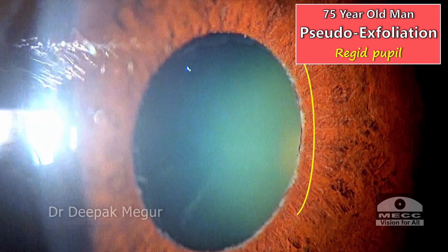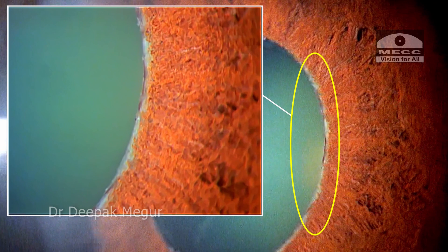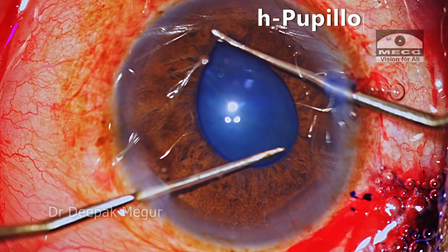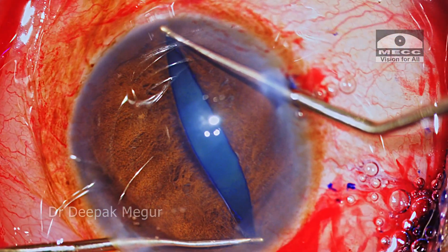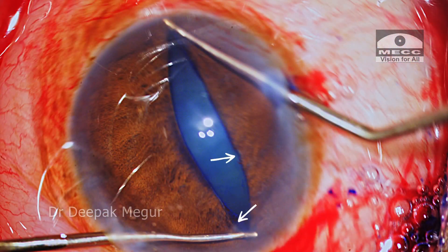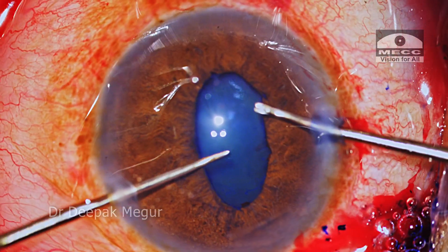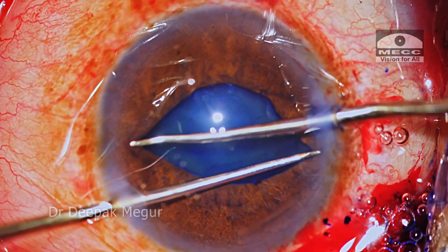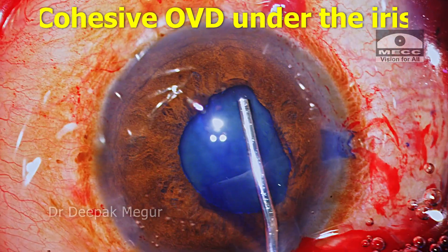Moving on to the next case of the rigid pupil. This is an elderly man with pseudo-exfoliation. We can clearly see the areas of sphincter atrophy. I'm performing stretched pupilloplasty and consciously stretching the pupil quite widely — a few sphincter tears are induced. I'm doing this excessive stretching since I was not sure about the ability of this pupil to dilate. But in most cases, this excessive stretching is not required and I wouldn't do it.